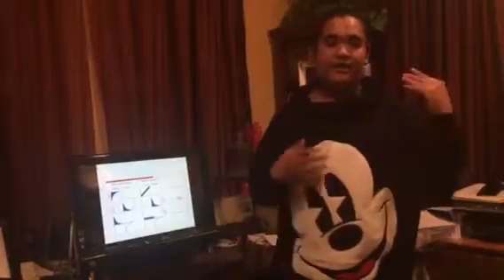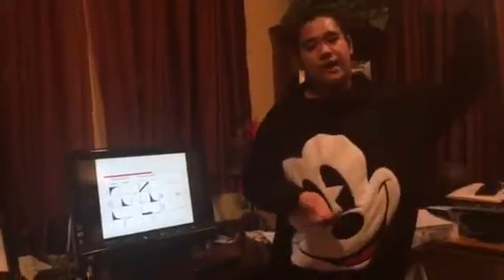So for flow, for pressure control, it's more of a descending pattern. Think of the flow for pressure control as the roller coaster. After the momentum, it's going down, right? When you get that feeling of your stomach turning and all of those. So that's basically it for flow. It's going down in a descending pattern.